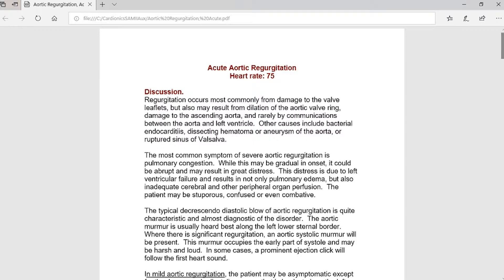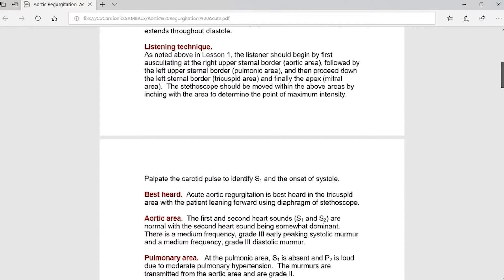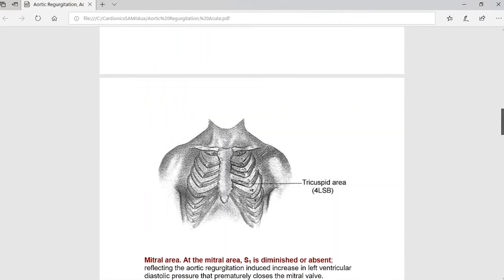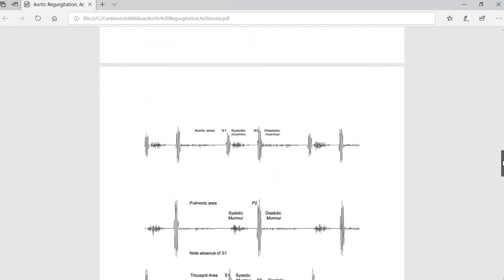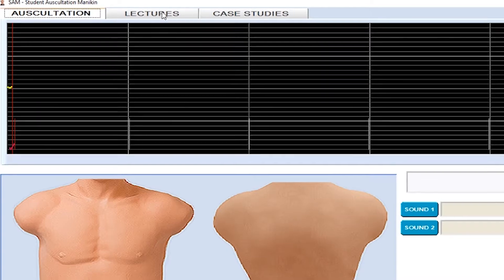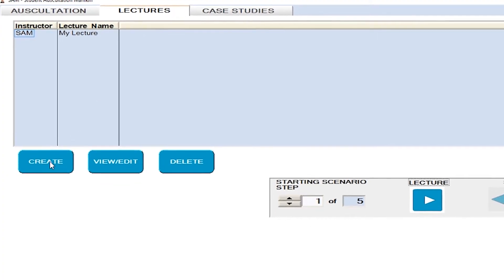Lesson guides are included with each sound to aid the student in their instruction. To view a lesson guide for each sound, click the lesson icon next to the play button. Custom lectures can be built in the lectures tab.